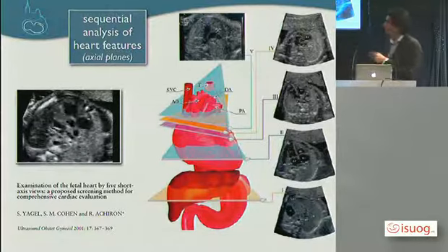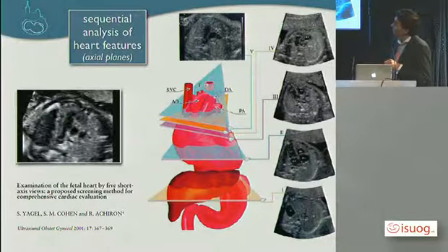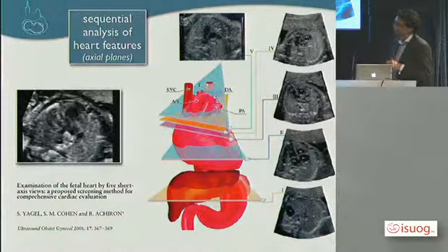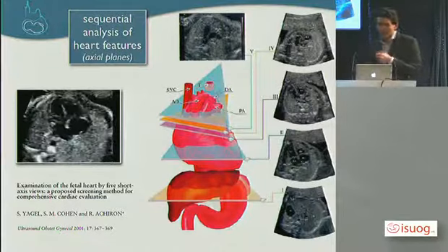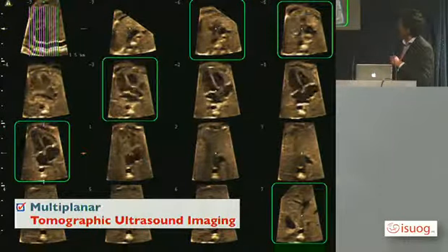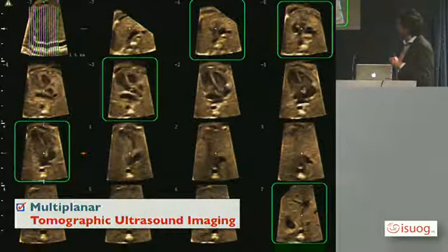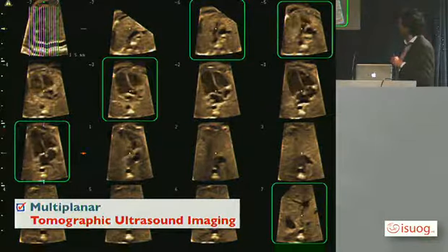For example, you can see here the sweep of the fetal heart, but it's difficult for you probably to see what I did with my transducer. Then I'm going here with the slide. We can see here there are only vertical, parallel, tangent planes. All planes are displayed here. From this picture, we can see the initial part of the fetal examination, the situs examination: the stomach on the left side, the abdominal aorta, the inferior vena cava.